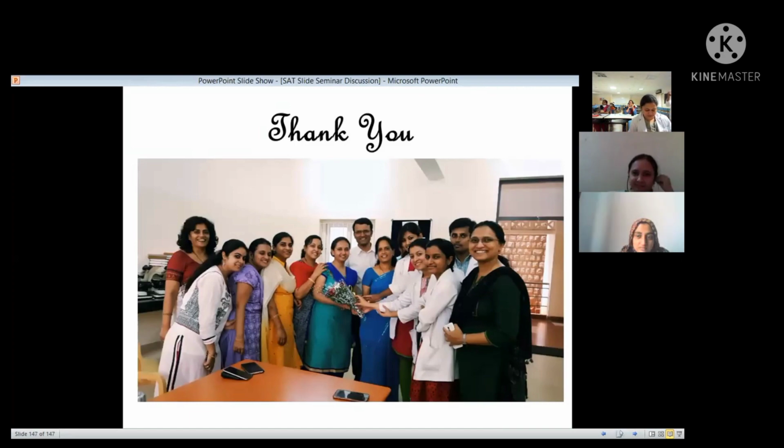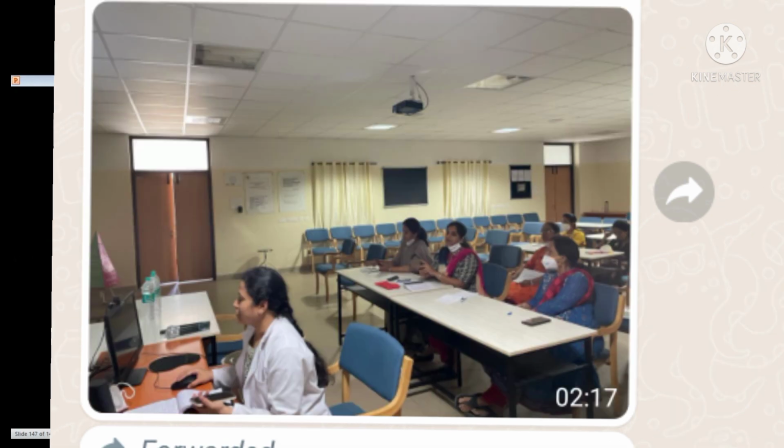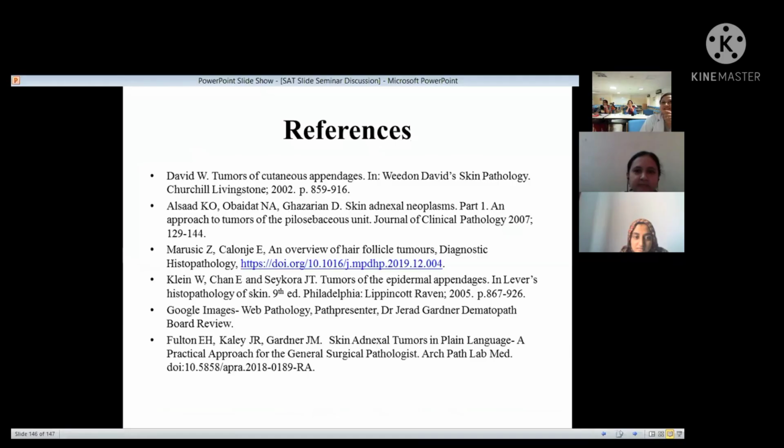Screenshot. Yes. I want that slide at least.